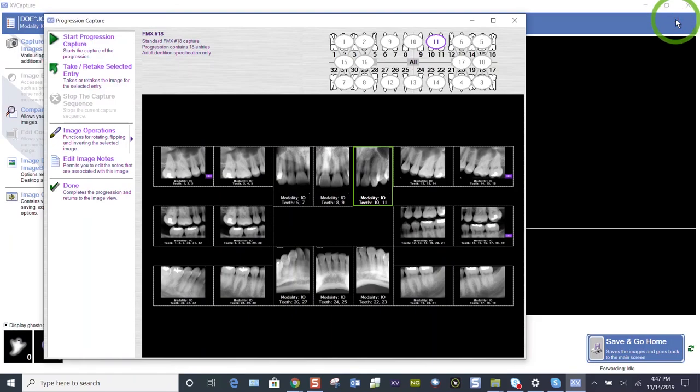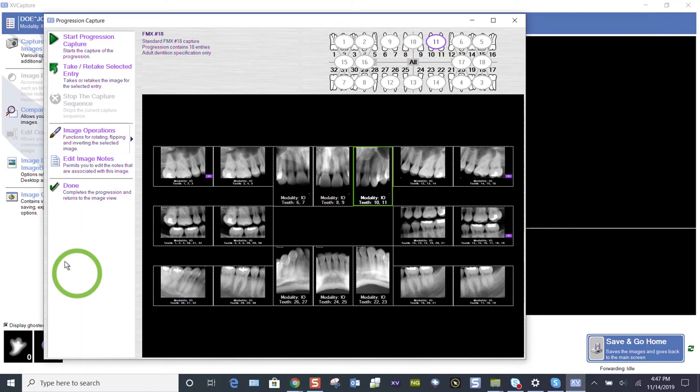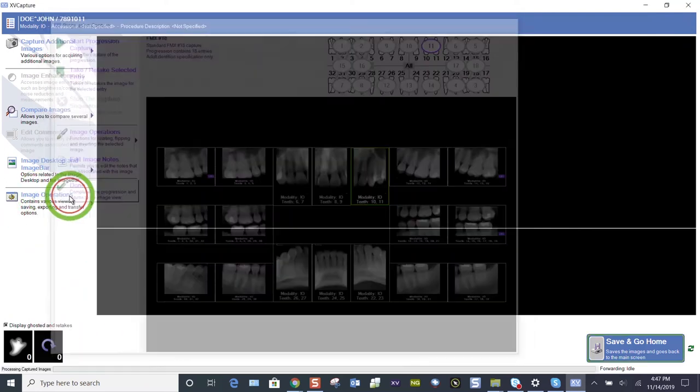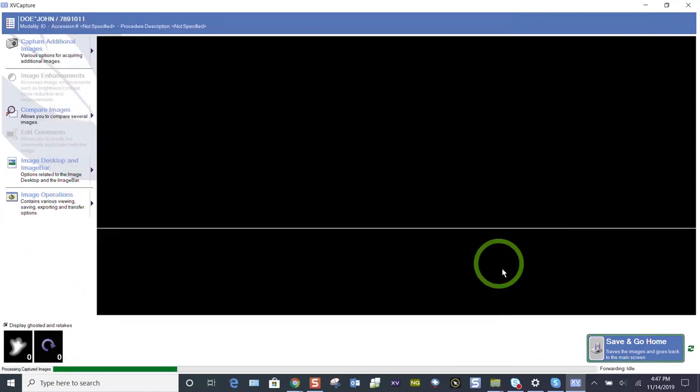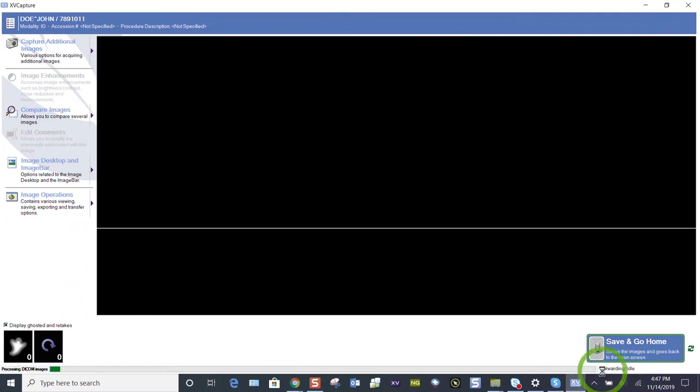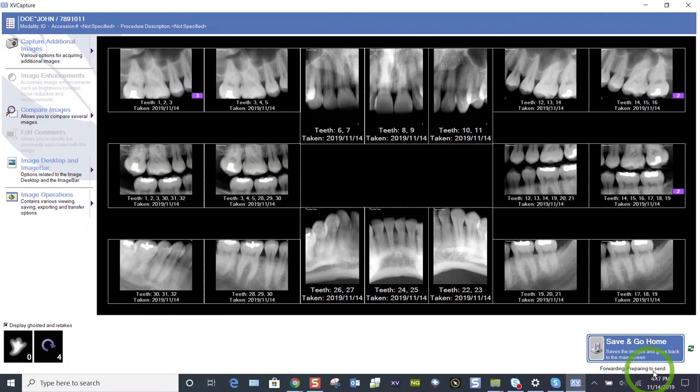But when you are done taking your images, you've taken all of your retakes as you went, you've assessed your layout at the end and decided to retake those that you needed to. When you're done, please press the done button, the green check mark done.